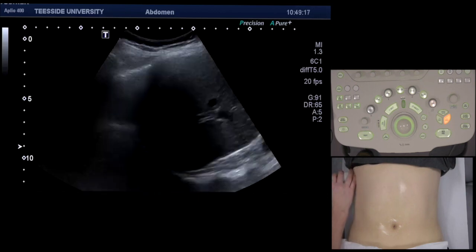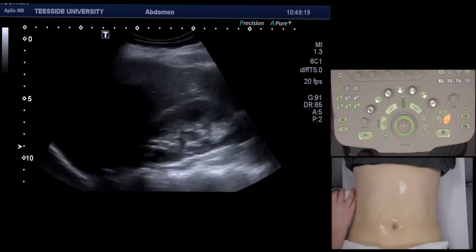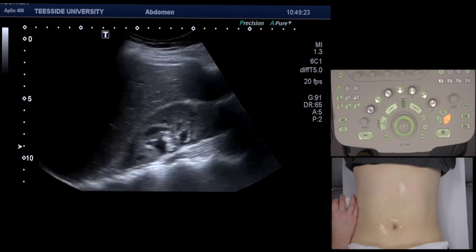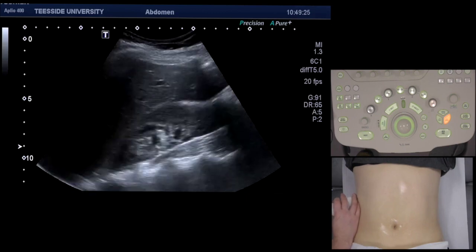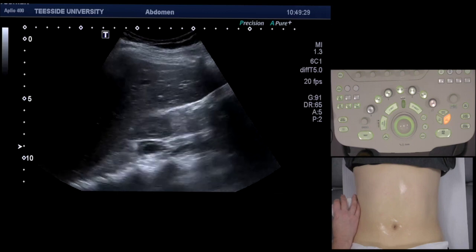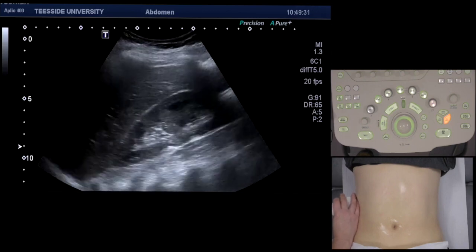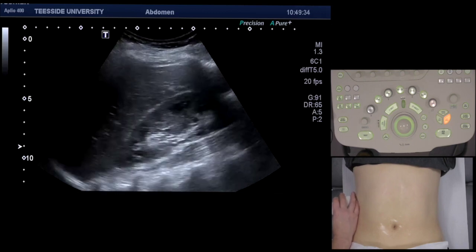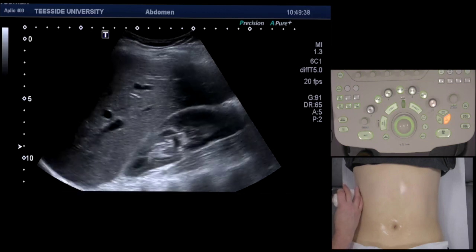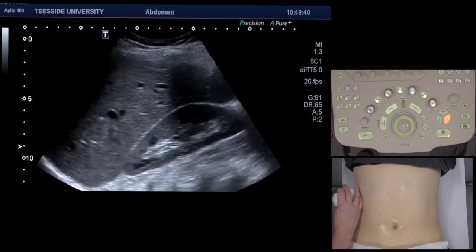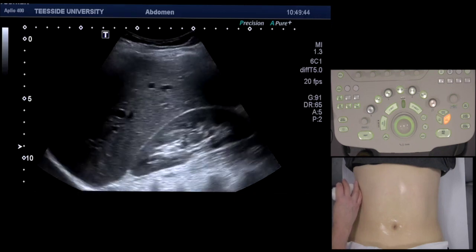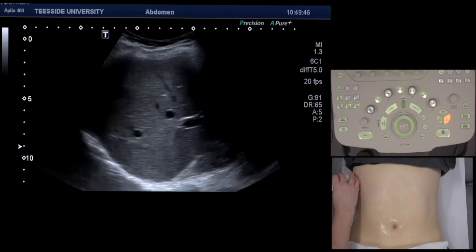What I'm doing here is looking for gross hepatic pathology and also any dilated intrahepatic ducts. You can also compare the echogenicity of the liver to the echogenicity of the kidney — the echogenicity of the kidney should be slightly less than that of the liver. As you can see, I'm just moving up and down the rib spaces.